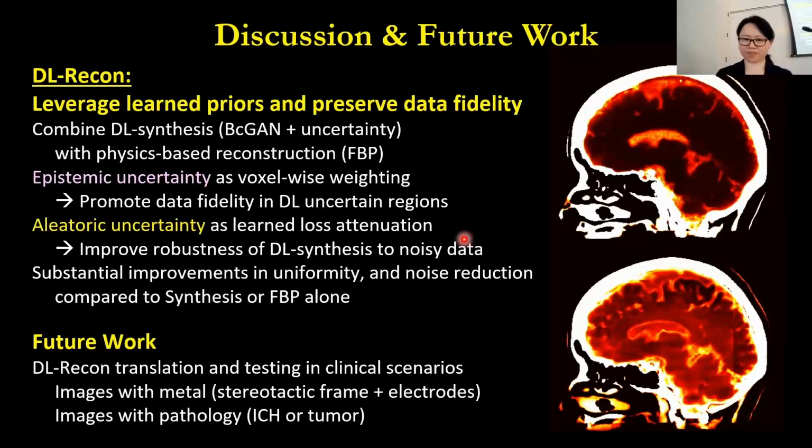Thank you for the question, Matt. When you say it's irreducible, I guess you mean that through more and more modeling, you couldn't get rid of it. Yeah, because that's the inherent noise in our input data. So we assume that the aleatoric uncertainty is heteroscedastic, so it varies more with noisy inputs. It's some characteristic we learn from the input image. So I think quantum and electronic noise comes into part of it.